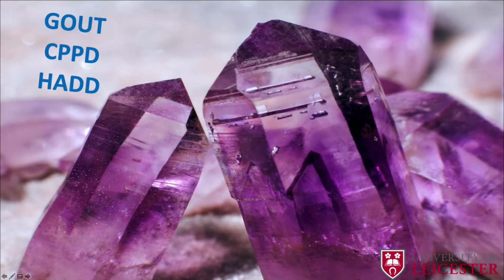Okay, so in a nutshell, that's all of the spondyloarthropathies that I wanted to cover in this lecture. I know that's quite short, but it just gives you a basic understanding just in case you do encounter any of those. The next part of this lecture I'm going to focus on is actually the crystal diseases, and really talking about three main ones. And I think there are some very specific manifestations of these radiologically that can really distinguish between the two. I'm going to try and cover this in a case-based format, rather than just doing a didactic lecture with just bullet points.